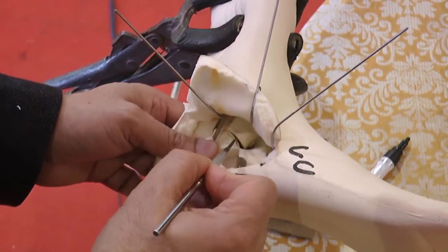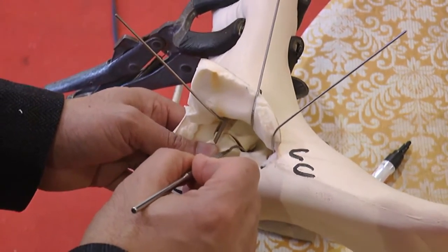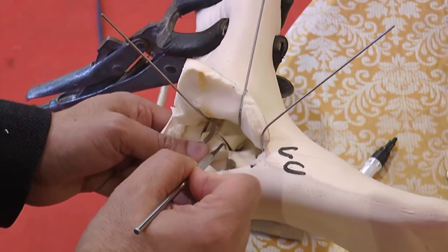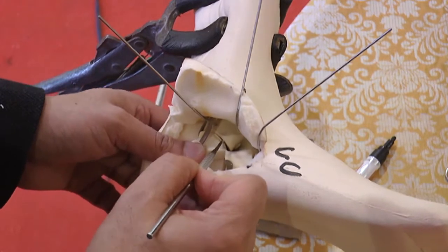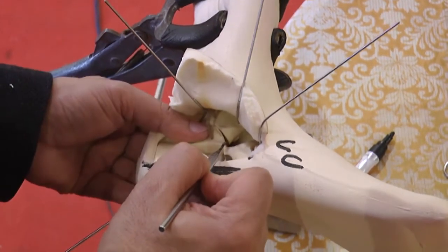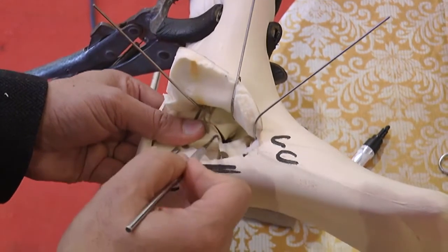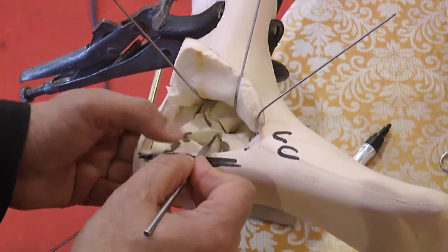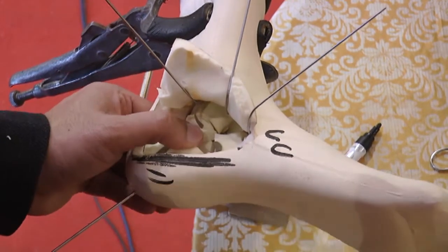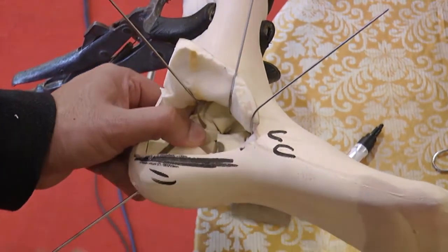Otherwise, you see the articular surface of the undersurface of the talus edge and the anterior edge of the articular surface have to match. Generally, the mistake is to lift less and not more. So most of the times we end up somewhere here, which is not good. So you have to lift it up all the way back, and then provisionally fix it with a K wire.